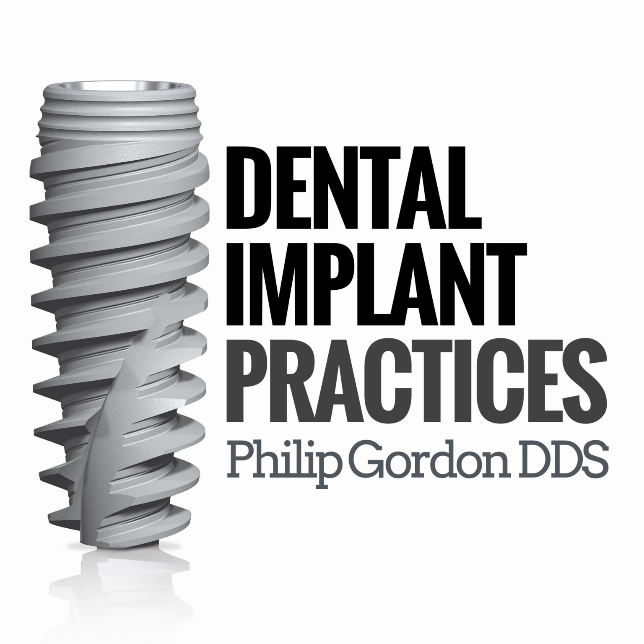Either way, you're going to be suturing the flap closed and taking a final radiograph to make sure the cover screw or healing abutment is properly seated and the implant is properly angulated. If something needs to be removed or readjusted, it's always better to do it before the patient leaves the office and not when they come back with a problem. So definitely something to think about. Radiographs could be of your paralleling pin, one of your surgical drills, and the final placement of the implant, and then to check for the prosthetics to be fully seated, whether that be the cover screw or a temporary screw. So you definitely want multiple radiographs during the procedure while it's going on.